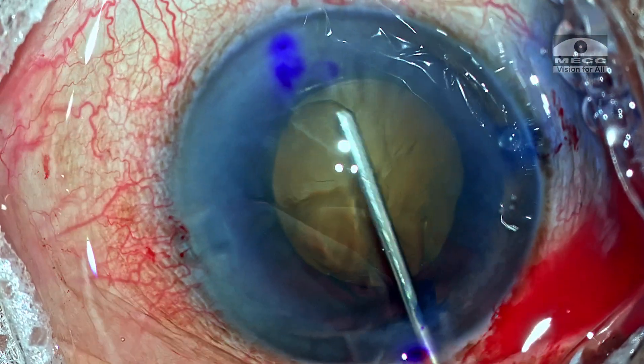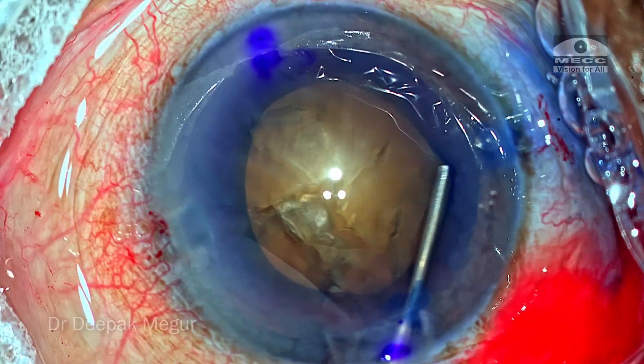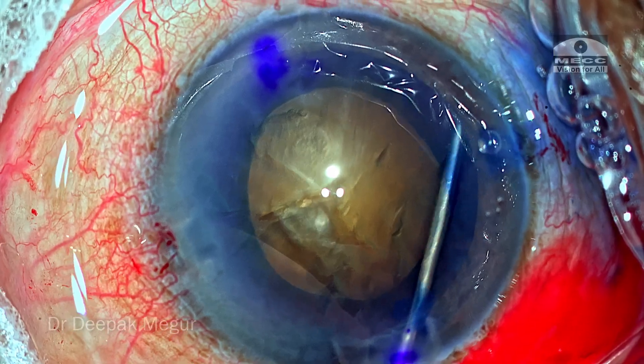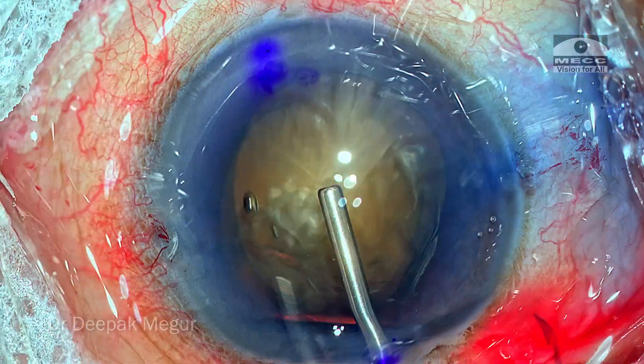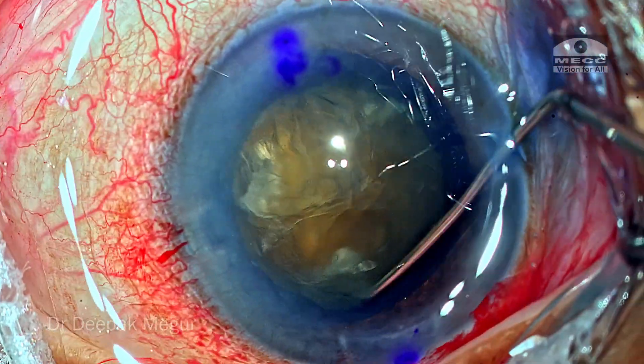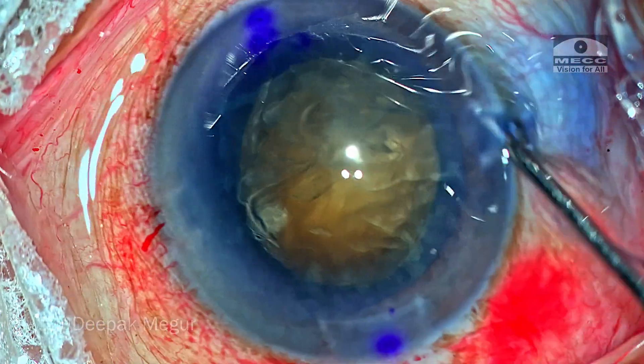A very gentle hydrodissection to ensure that the capsular bag is free from its attachment to the cortex and lens matter. Very little fluid is used. The nucleus is tapped down. Nuclear rotation is confirmed and it's time to proceed with phacoemulsification.